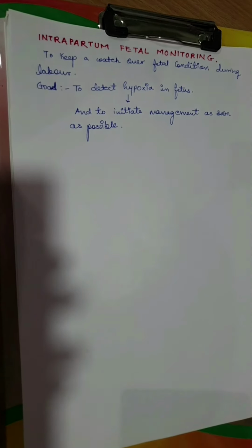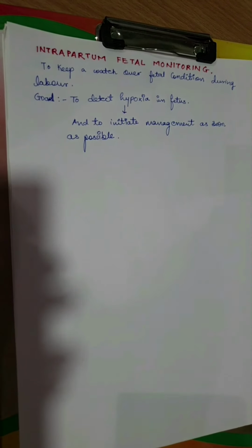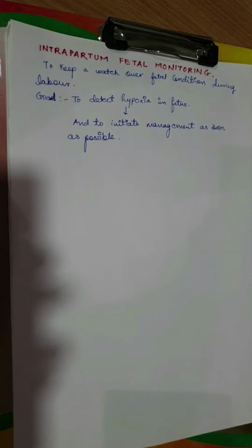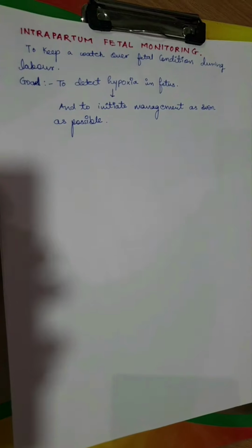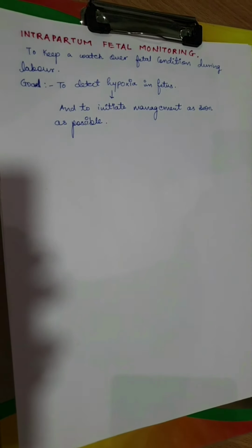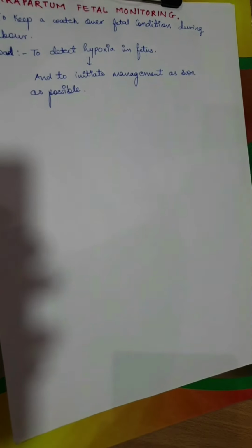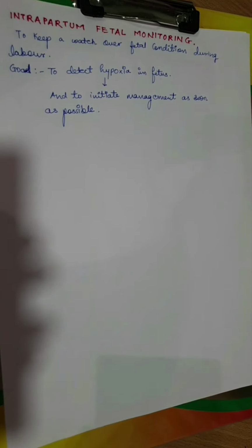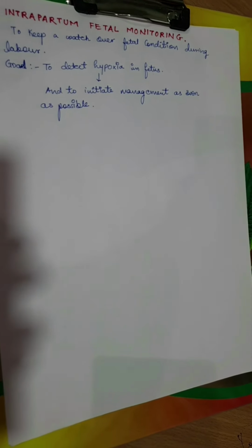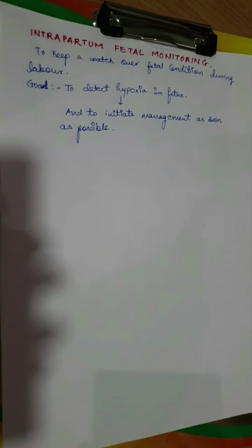Now, if we just avoid this intrapartum fetal monitoring, what will occur? We will not be able to decide whether the fetus is in hypoxic condition or not during labor, if it is a normal labor, or what management we should further conduct. And if the fetus goes into severe hypoxic condition in labor, this might be associated with metabolic acidosis, and this metabolic acidosis will cause fetal organ damage, and this will ultimately lead to fetal death. So intrapartum fetal monitoring is of the utmost importance.